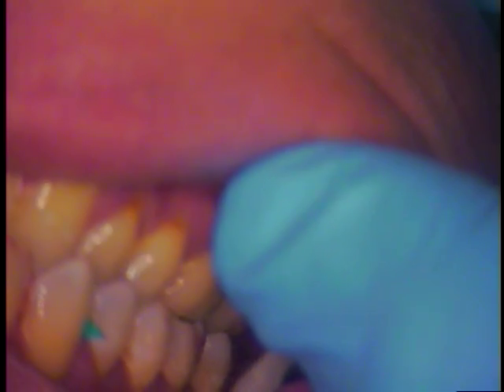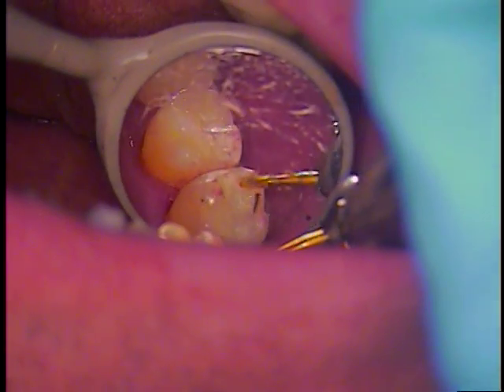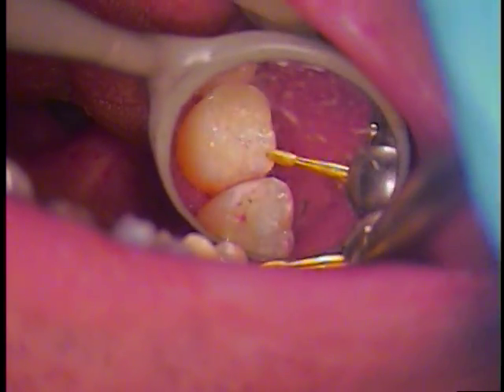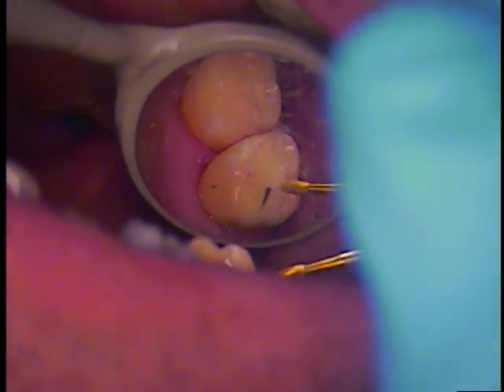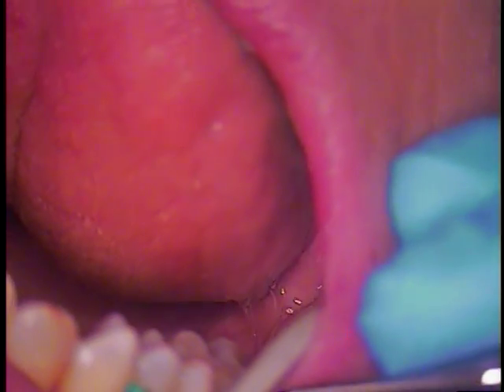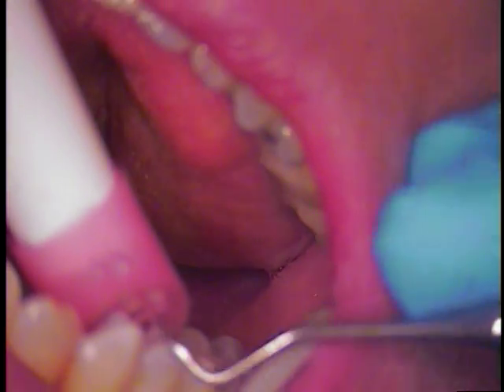Let's put that in - tap tap, open, and tap again. Let's just see how your teeth come together. He's almost end to end on the molar, so that's probably why you're getting a cusp tip that's right on orthodontically on this side - that should be pretty close. How does that feel to you, John? Feels good. Bite down, grind a little bit - pretty good. Looks like you interdigitate pretty well. Okay, still got a little high side.